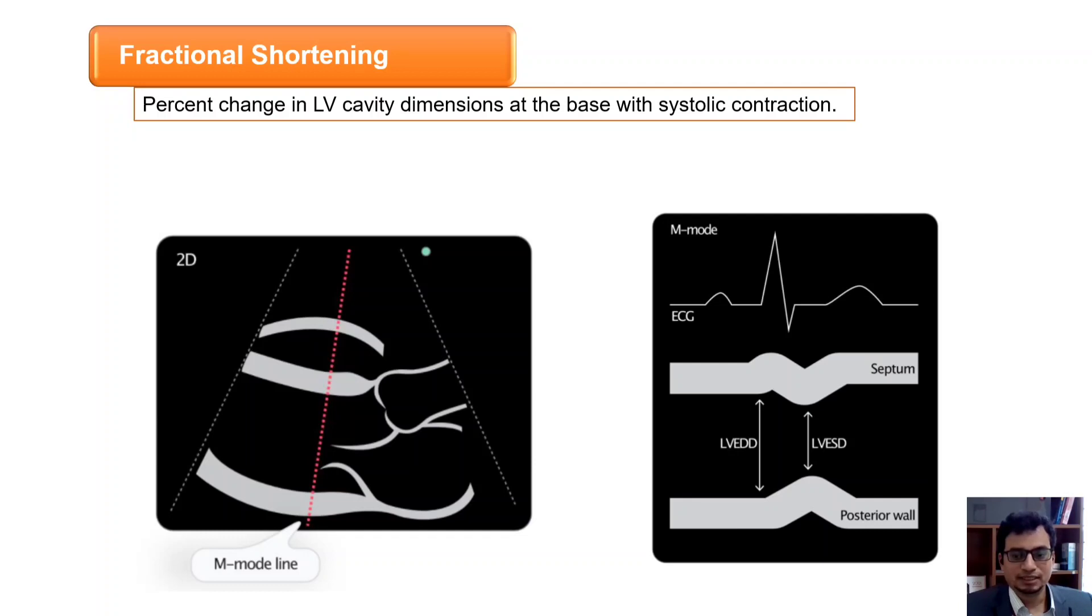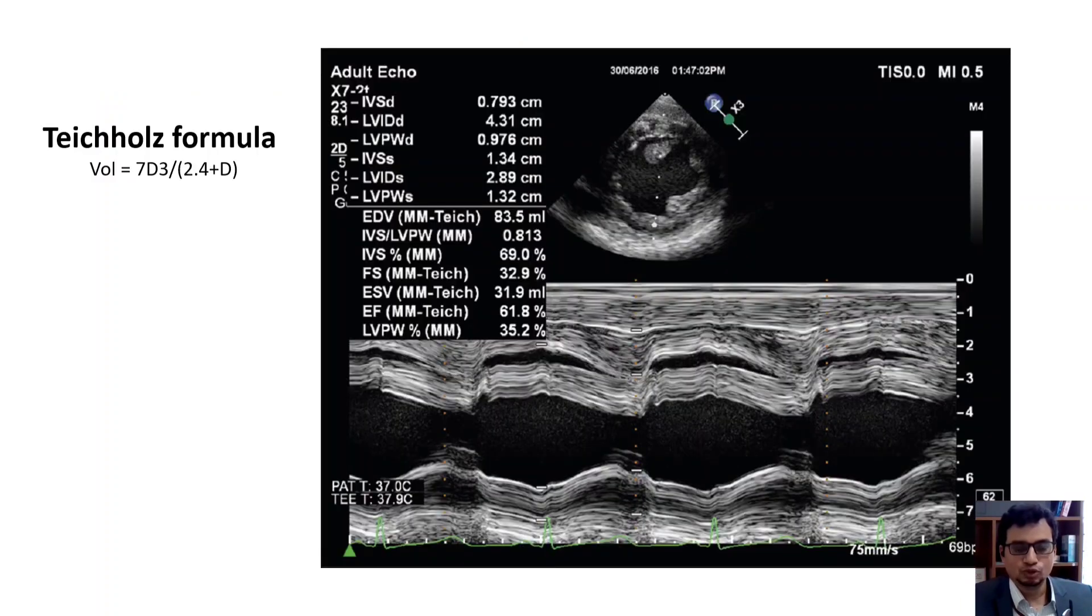Two measurements are taken: left ventricle end diastolic diameter and left ventricle end systolic diameter. Then this formula is applied to calculate fractional shortening. The value more than 28% are considered to be normal.